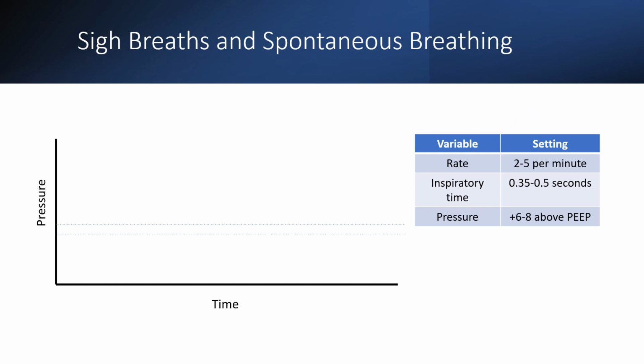The jet ventilator works in tandem with a conventional ventilator. While the jet ventilator is administering pulses of fresh gas at high rates, the ventilator maintains a bias flow through the ventilator circuit and PEEP. This allows for spontaneous breathing, which is very beneficial for the continued development of the respiratory system in the preterm infant.